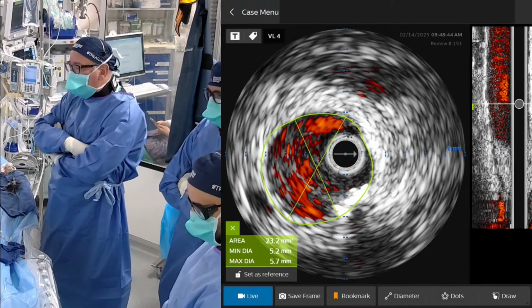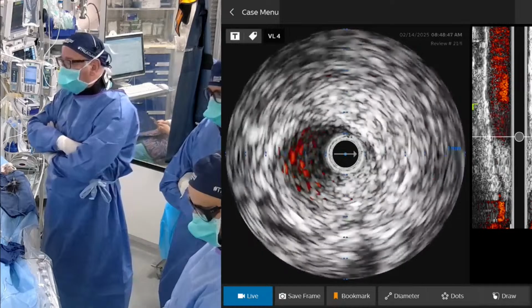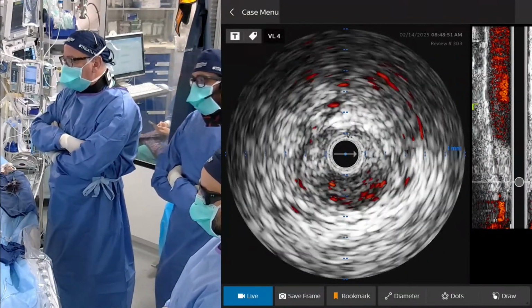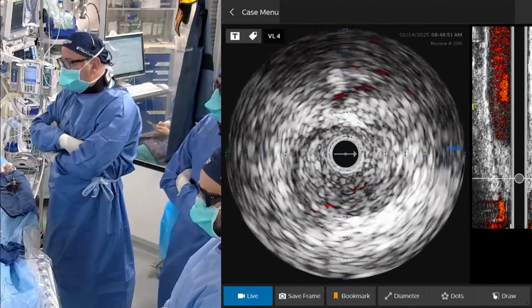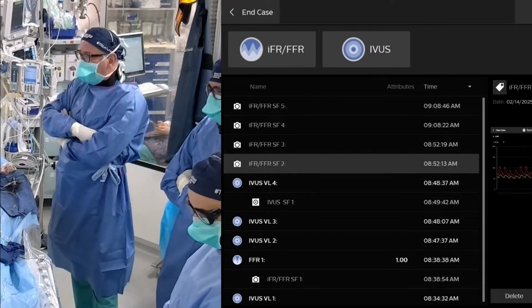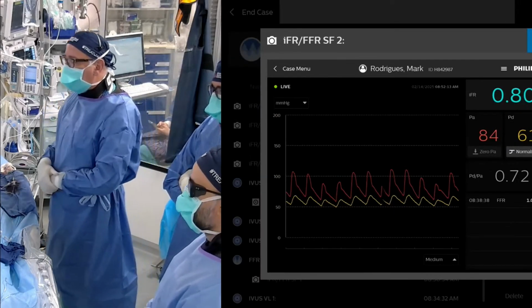We did the same thing with chromaflow. And again, you just see it very nicely obliterated right there. That's probably the best image that we have. So again, just a really nice example of the inflammatory changes we're seeing in the renal artery.